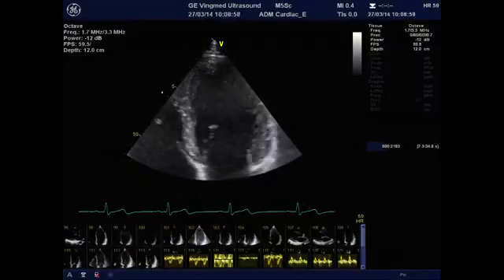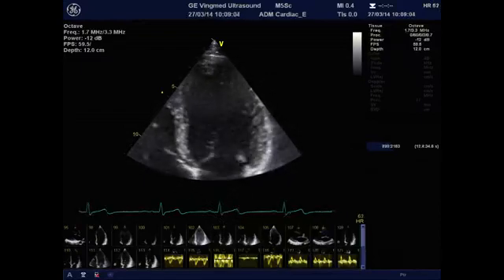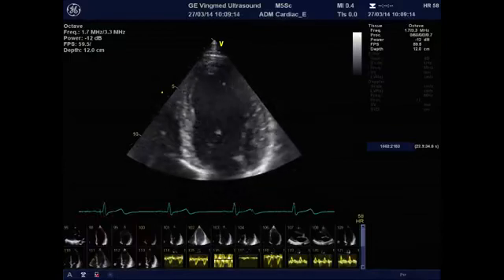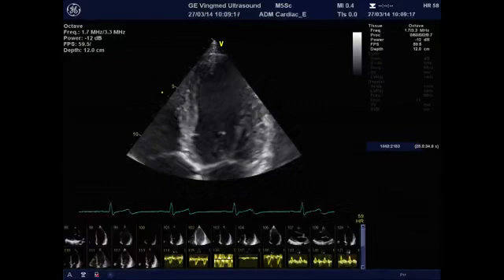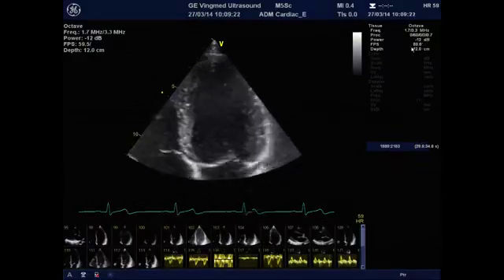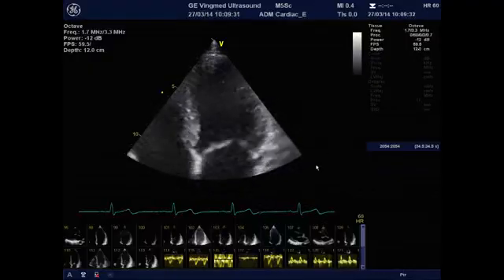The last point I want to show you is speckle tracking. If you want to do speckle tracking, you do the same. You look at regional function with velocities, with strain rate, or with strain, but you do this angle independent with a grayscale tracking algorithm, which is available on most echo machines. It's important there to look very well at the frame rate, because these algorithms need to have a certain specific frame rate. In this case, the frame rate should be between 50 and maximum 90. If it's too high, the algorithm doesn't work. If it's too low, you also will get errors.